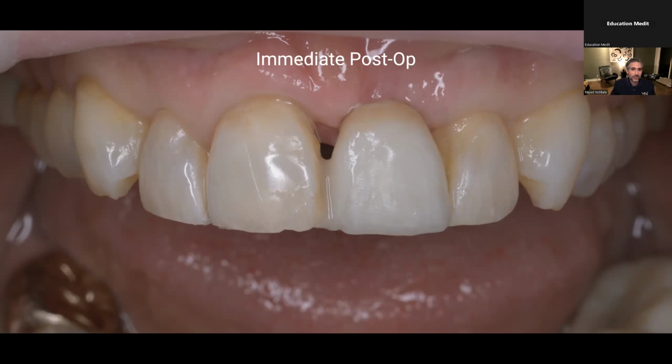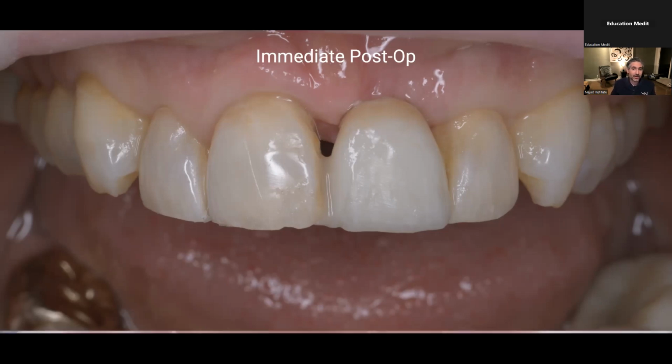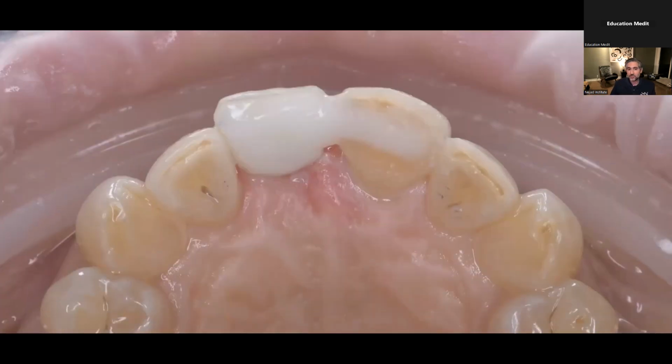And so this is a very predictable and very stable procedure. Using the Onyx Tough, it's very resistant to fracture. So this is what it looks like from the lingual surface. You can glaze or polish. Sometimes I do both of them. And of course, make sure that there's no occlusion.